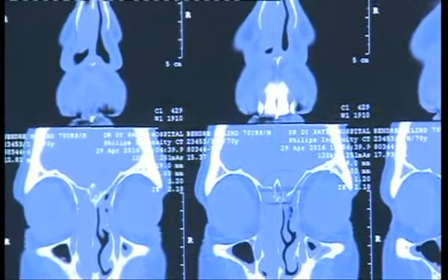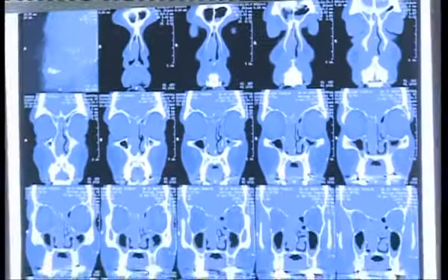Yeah, I think everything has been discussed by Dr. Satish, except that all my concentration will be towards the frontal, because as a FESS surgeon, I am always concerned about the most difficult part of the surgery. I don't have a pointer, so I can go here. Can you bring the scan there? As any FESS surgeon, this is what you have to look at. Whenever you train, your eyes should go towards the frontal. That should be your first checklist.